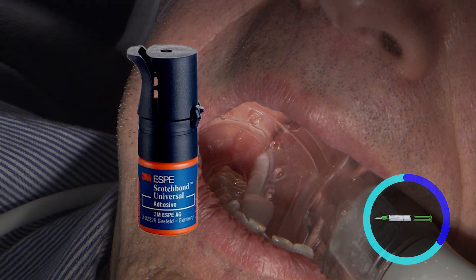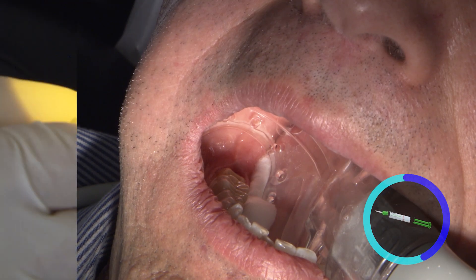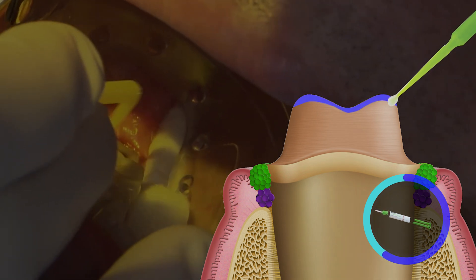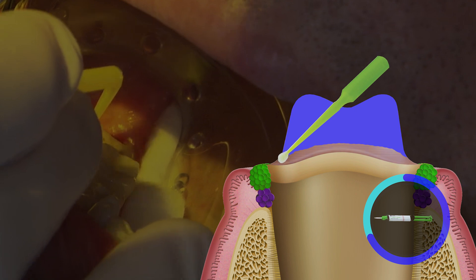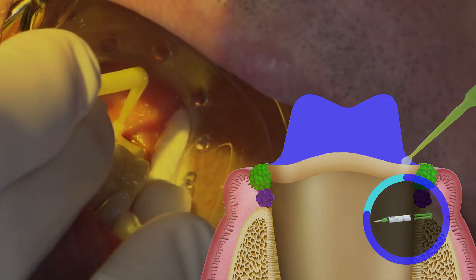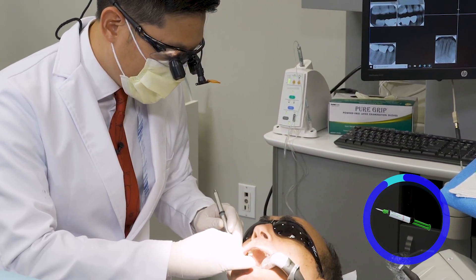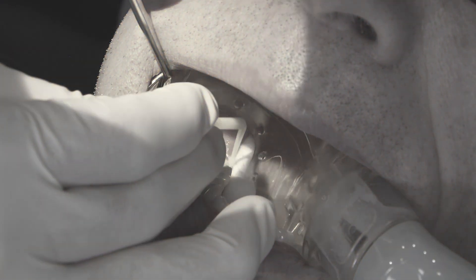Using Scotch Bond Universal, we're going to apply a thin coat of the bonding agent. I normally finish with the margin. So I start off on the occlusal surface and begin working my way down the axial surfaces of the prep. The very last thing I try to touch will be the margin, because you may potentially contaminate the microbrush by touching some of the surrounding soft tissue — especially if there's heme, saliva, or crevicular fluid in those areas. That just helps minimize the risk of contamination.